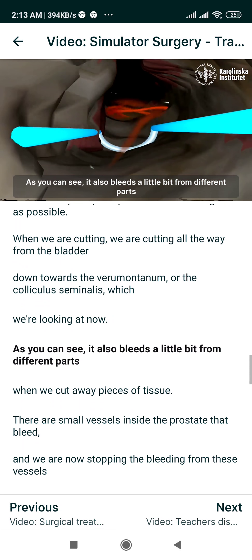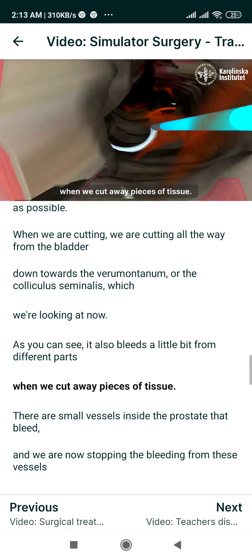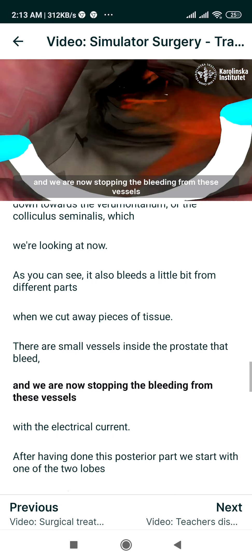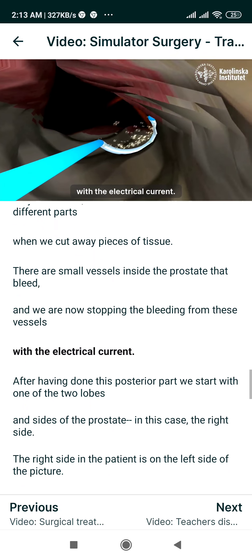As you can see, it also bleeds a little bit from different parts when we cut away pieces of tissue. There are small vessels inside the prostate that bleed, and we are now stopping the bleeding from these vessels with the electrical current.